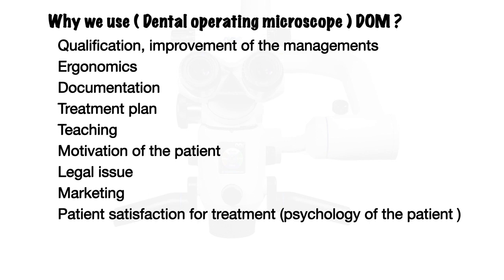the following questions, which are also of interest to many endodontists and in many articles or papers that I read on the net: qualification or improvement of management, ergonomics, documentation, treatment plan, teaching, motivation of the patient, legal issues, marketing, patient satisfaction with treatment, or sometimes the psychological status of the patient.